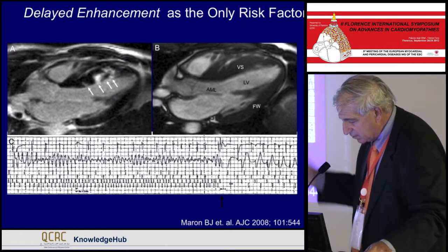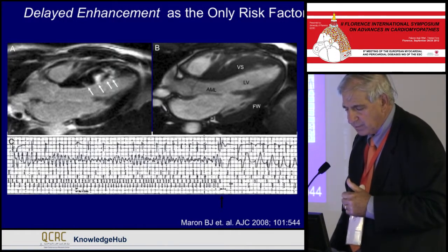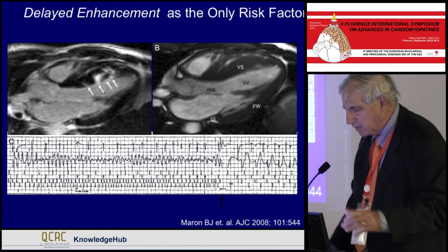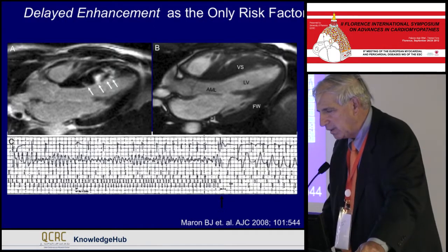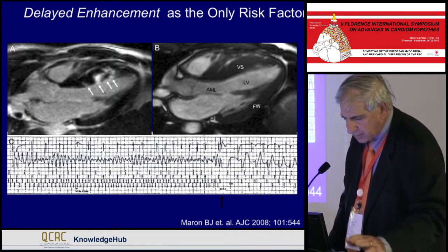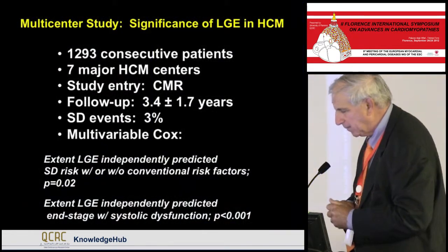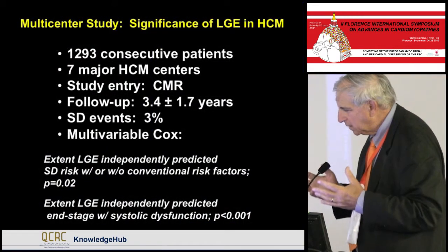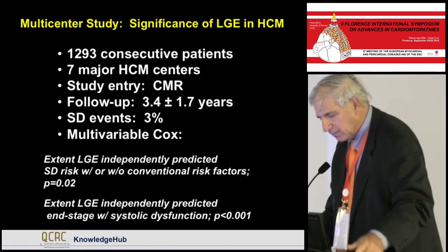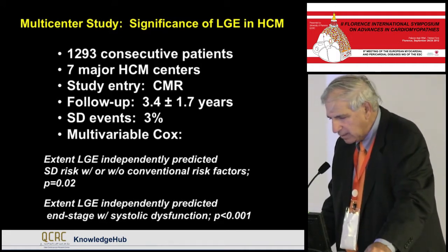His mother is a physician, and there was a discussion, and eventually a device was implanted, and then you can see that it only took about 9 months for it to terminate spontaneously ventricular fibrillation. So a dramatic experience like that made us think that we really needed some evidence relative to the extent, not the presence, the extent of LGE. It's the only thing that seemed to make sense.